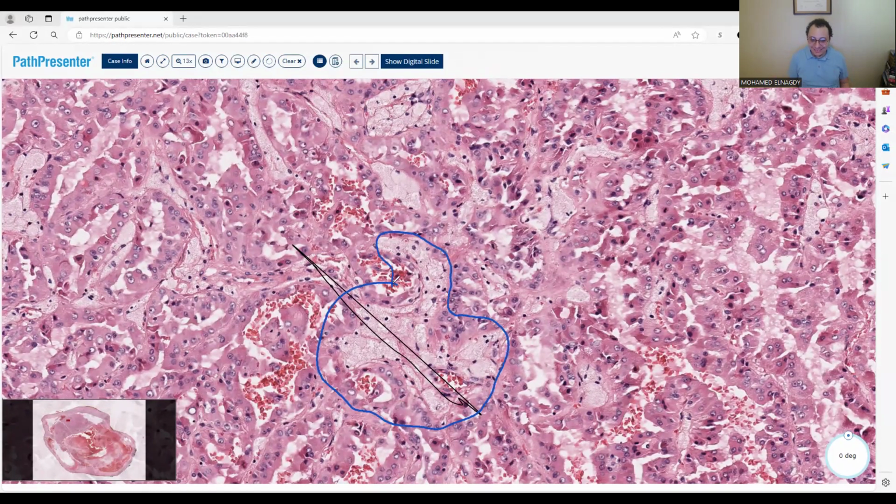The cells in between are the macrophages, the foamy macrophages. Did you see that, Abdurrahman? Yeah, this is the foamy macrophage? Yeah, but it doesn't look blue. So I'm gonna think like, is it papillary or papillary clear cell? So I'm just gonna order the stains, and it makes sense.